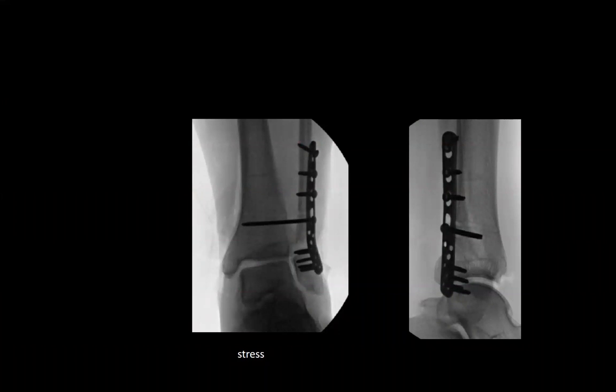Sorry, so what was the question? Sorry, Dr. Butler. The question is, almost always I check to see whether these things reduce prior to doing the surgery, just with a fluoro shot. You should be able to see whether it's reducible or not, if something is blocking the medial side. So we were able to get it reduced. This one was wide open medially. You're looking into the joint and see the ligament torn and the capsule completely shredded. This was a wide open 3A ankle.